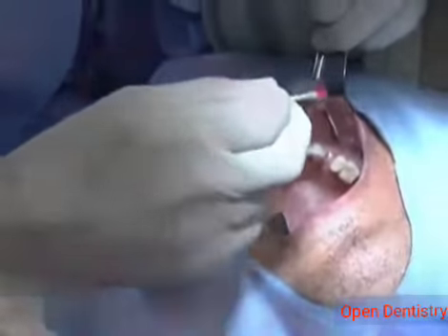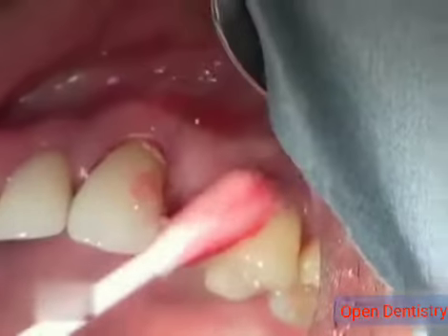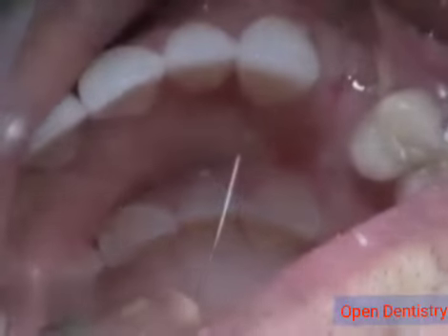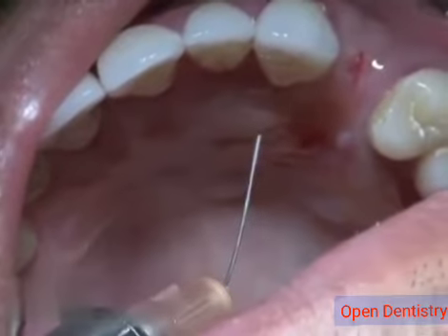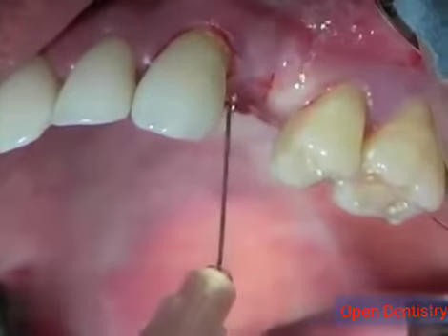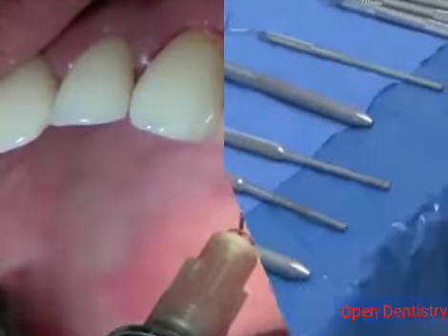Topical anesthetic is used for the surgical site, and local anesthetic can either be infiltration, as used here, or block anesthetic. Here, local infiltration anesthetic is used in the palate, on the crestal and buccal.